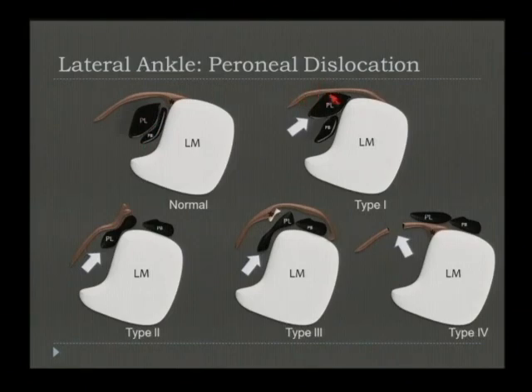Here we can see that the peroneal retinaculum looks like it's intact. However, the fibrous portion that attaches to the lateral malleolus has actually been pulled off and there is periosteal stripping. This is a case that is difficult to identify outside of ultrasound. This allows some gapping in this region, and the tendon, either the longus or the brevis, can sublux anteriorly into this gap.